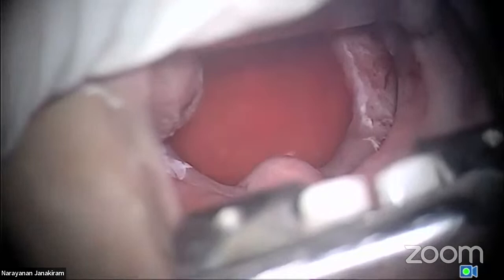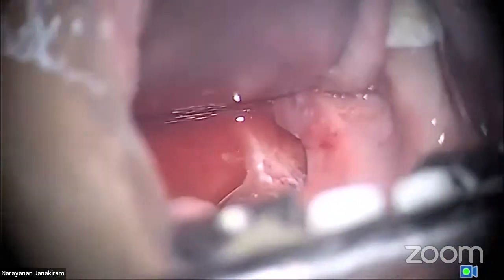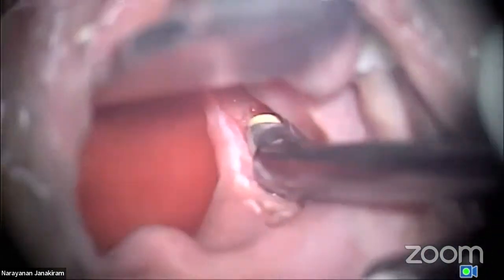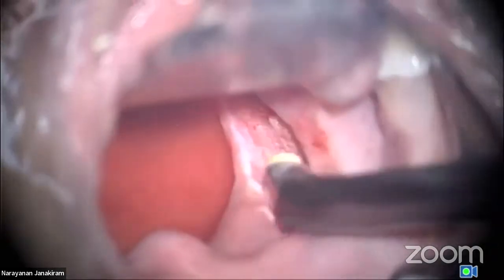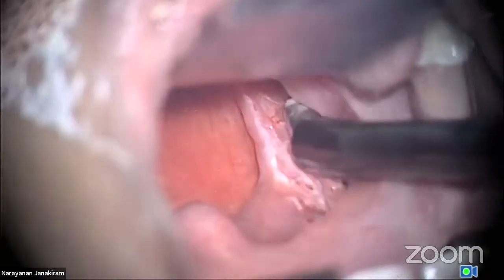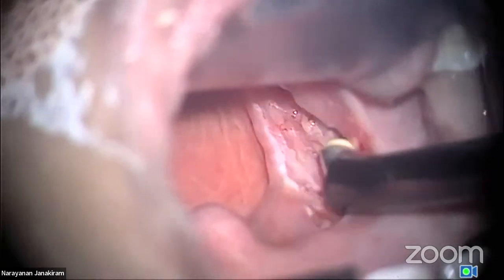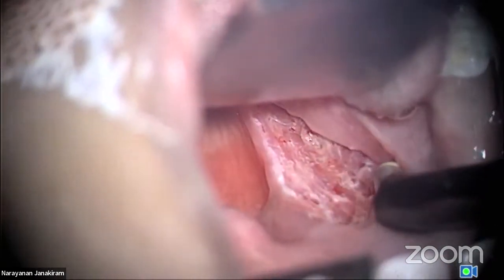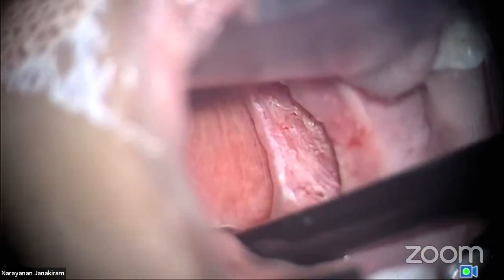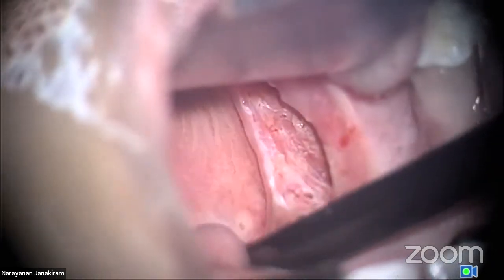Many people still are doing bad adenotonsillectomy, even the basic procedure like hold. See how much of the anterior pillar I have preserved. You see that? See how beautiful it looks. So beautiful. Absolutely no bleeding. Fossa looking beautiful. No breach of any of the caps, the muscle layer. You can see how nice the muscle layer looks.